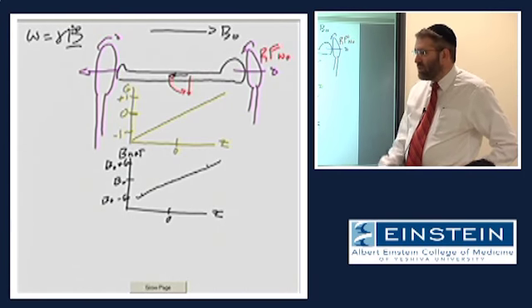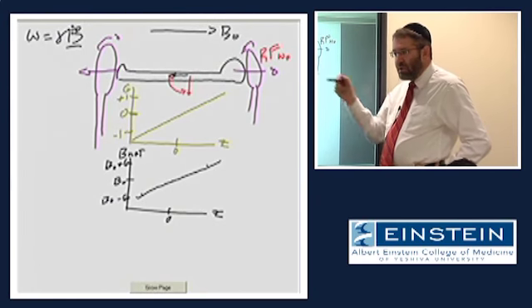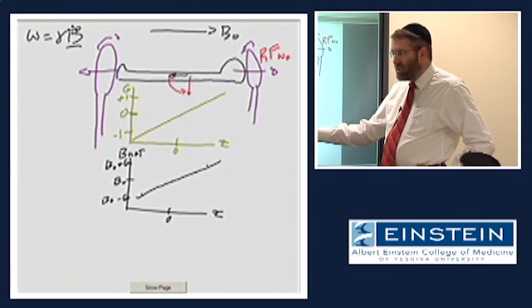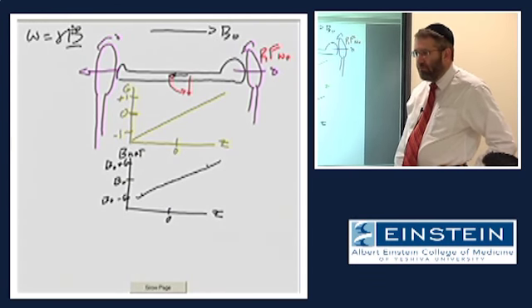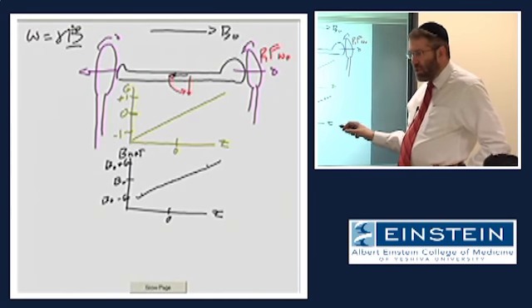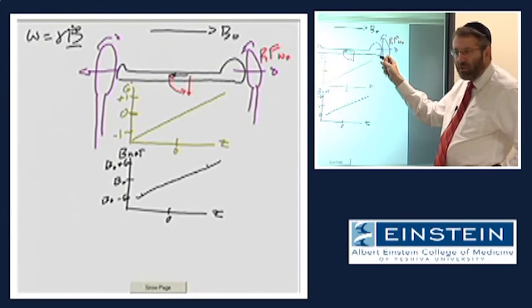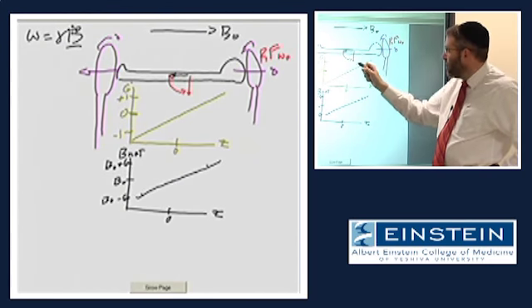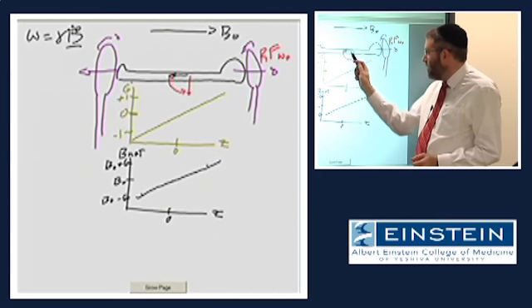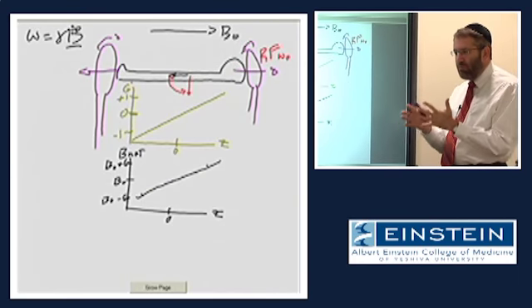So in the presence of this gradient magnetic field, if we do the same thing, you guys have a question? Yeah, why is there a 0 on the z-axis? What does that represent? What does this 0 mean? Yeah. This is the isocenter. It's not that the actual value of 0 matters. This is a location along Z. So instead of measuring from 0 to 100 centimeters, let's say, I'm going from minus 50 to 0 to plus 50. It's really arbitrary. I used 0 because of this concept of the isocenter of the scanner, which is important to keep in mind.